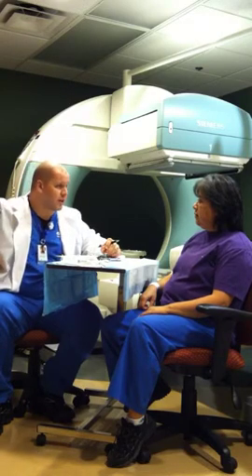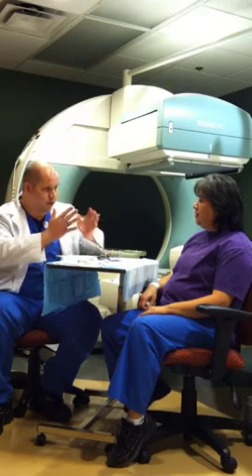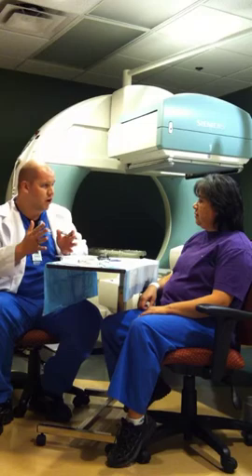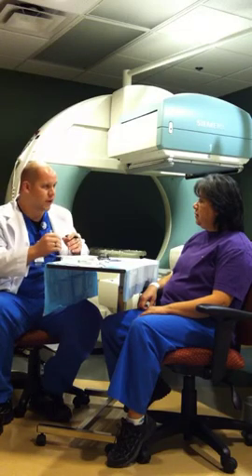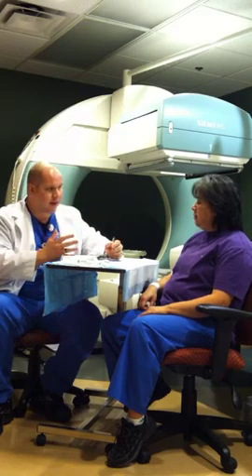One electrode on each collarbone and one down on your side — actually, on the other side. That's going to gate your heartbeat and divide the picture up according to each phase of your heartbeat. That way, they can look at your heart in a kind of still motion — one phase, one phase, one phase over and over again — so they can see it without it being a blur. They can calculate your diastolic and systolic readings and use those calculations to get your ejection fraction. The imaging software will do all of that.